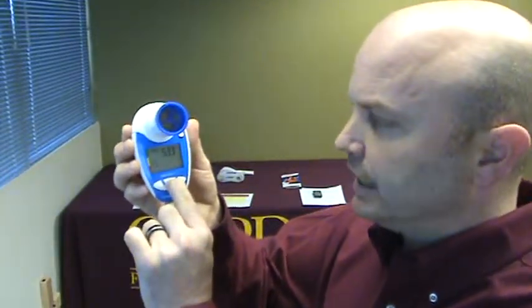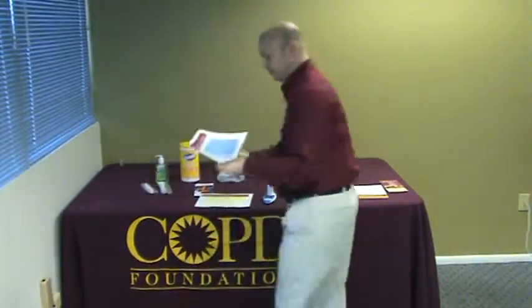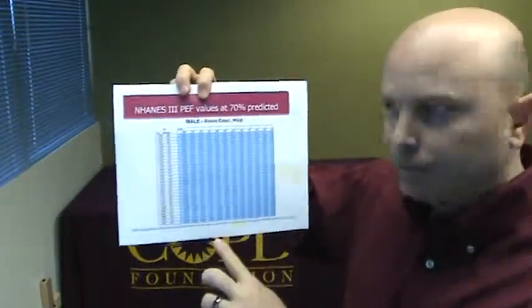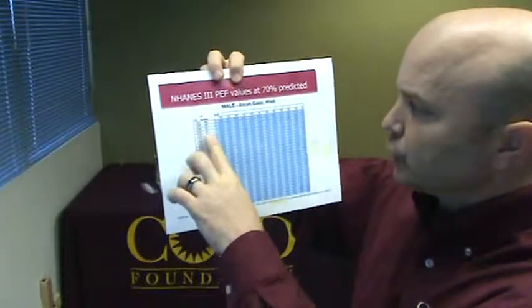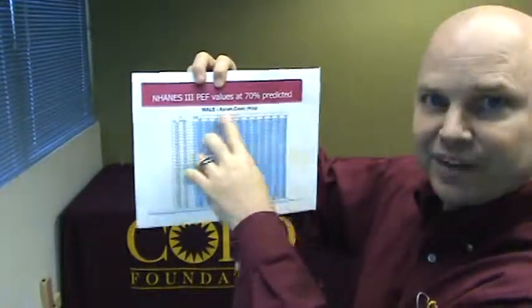To make sure of that, you're going to press and hold the enter key in the middle, and it will tell you that test number one, which was the latest test you performed, was 600. You're going to use your external tables, which are based on NHANES 3 values, set at 70% predicted.